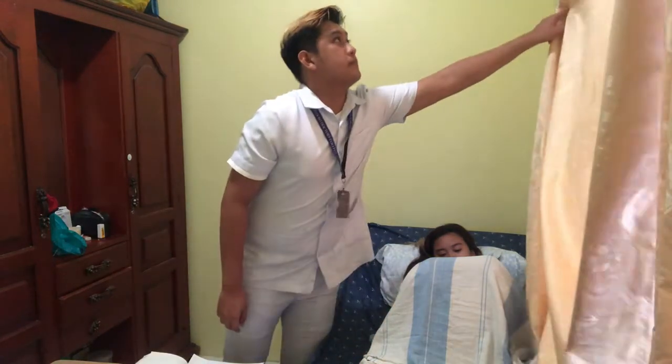Okay, so next we will provide privacy by screening or closing the room. By doing this, we're making the patient feel comfortable and respecting their privacy. We'll also position the patient in dorsal recumbent with the knees flexed and drape them to cover areas that we will not be assessing, and to also ease the patient's tension.